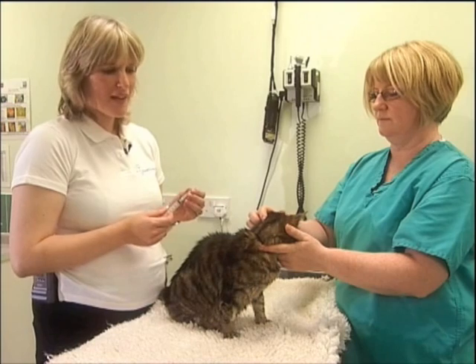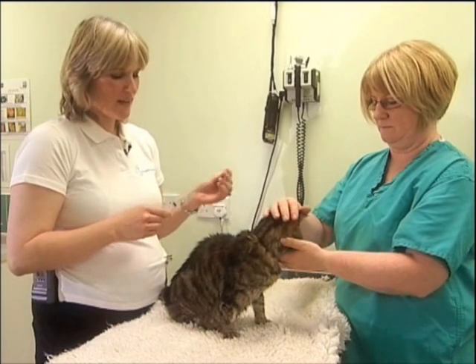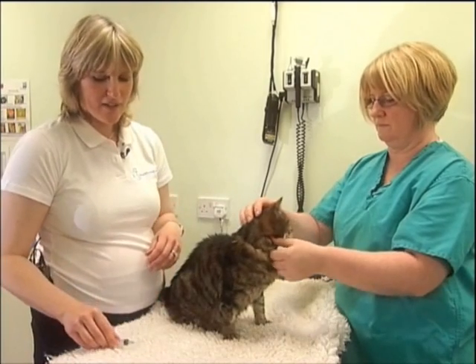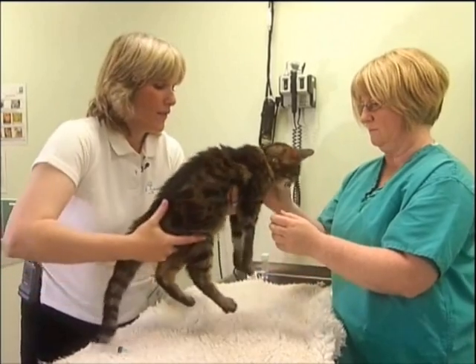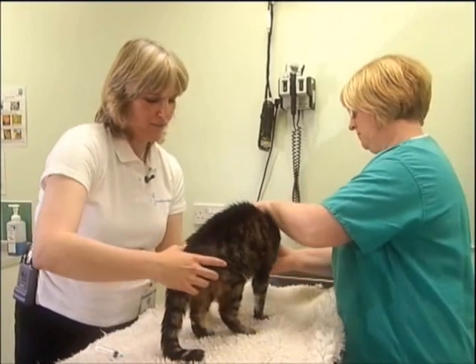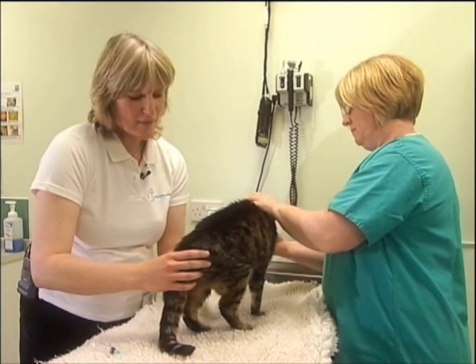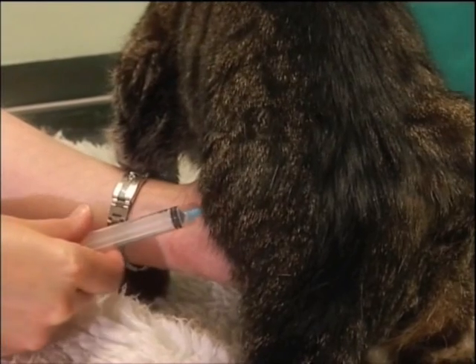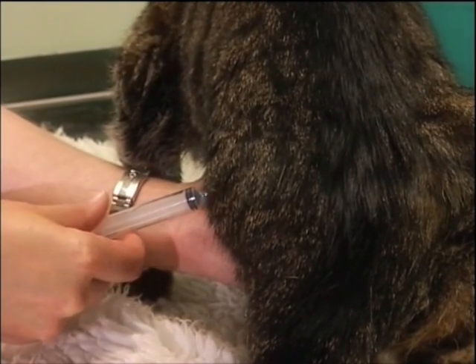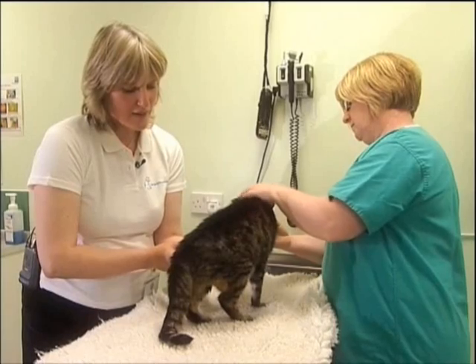Once I'm happy that I can palpate the cat's bladder, I can remove the tip of my needle and get into position to collect a sample. I stabilise the bladder, and once I'm happy it's stabilised, I introduce the needle over the skin, slide it in very gently, and then collect a sample.